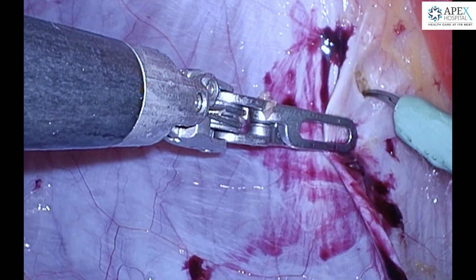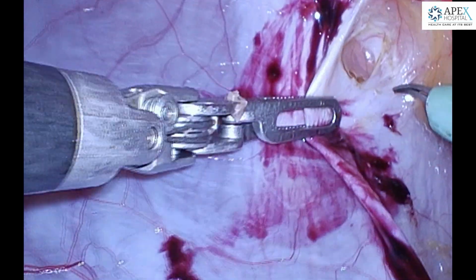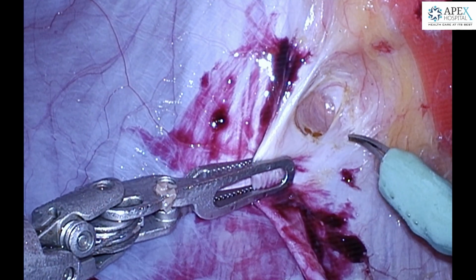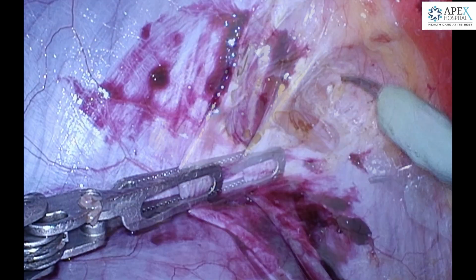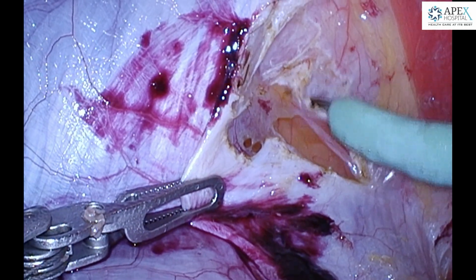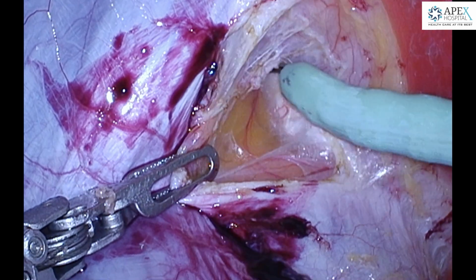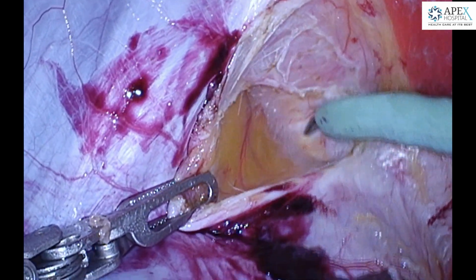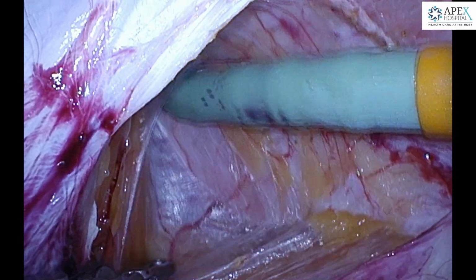After this, the robot is docked and a monopolar cutting scissors in the right and a grasping forceps in the left is used to start the dissection. Here, the posterior rectus sheath is being divided in the M2 region to access the extraperitoneal space so that we can make the crossover to the right rectus space.